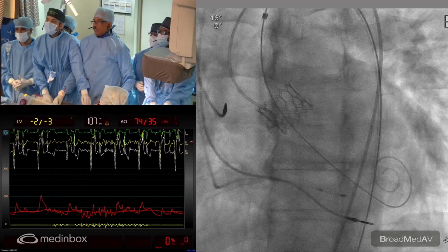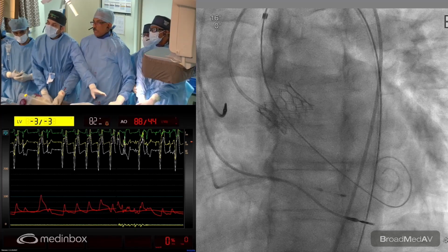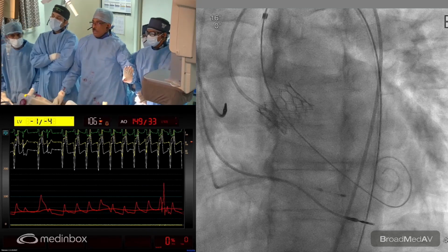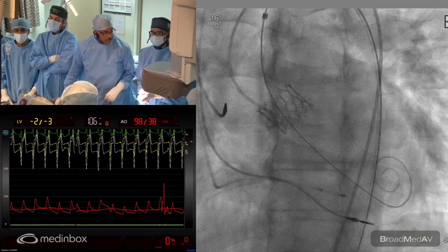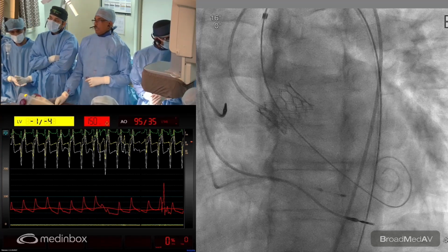Okay, now pressures are coming. Pressures are coming, sir. Just support it. Don't get panicky. We'll take a normal shot or we'll check the coronaries as well. There's no ST change. We want no pacing rhythm. It's perfect. Don't worry. The pressure is up to 80 now, and it's coming up.